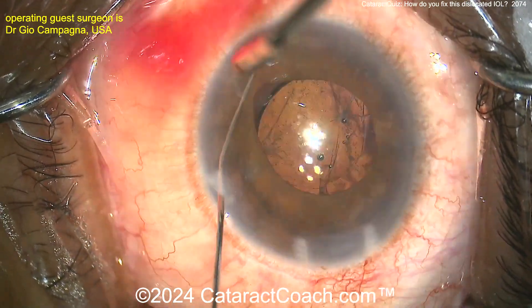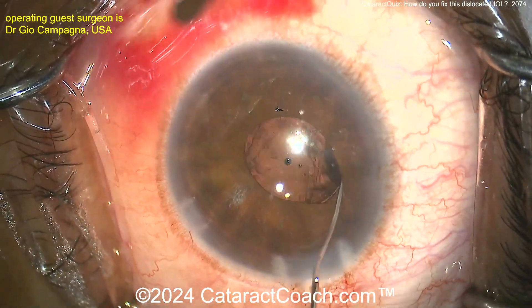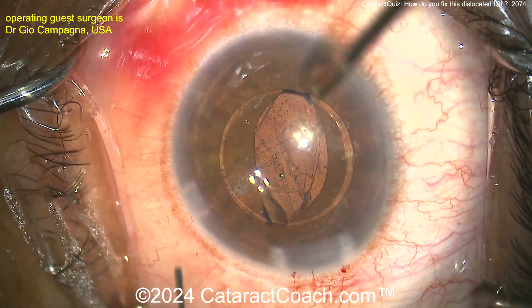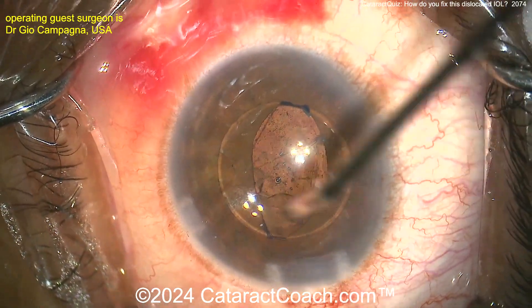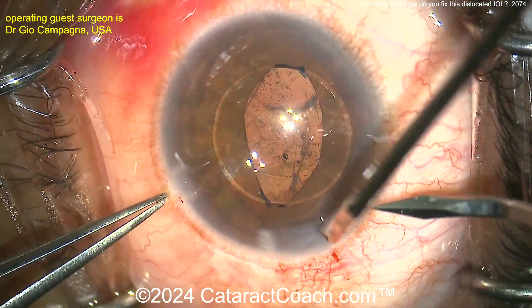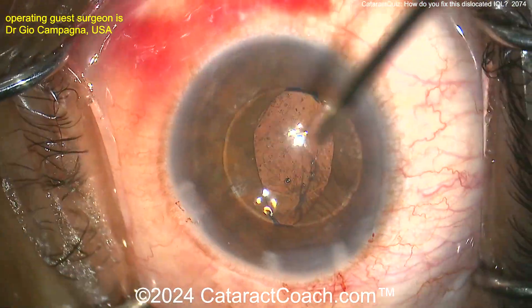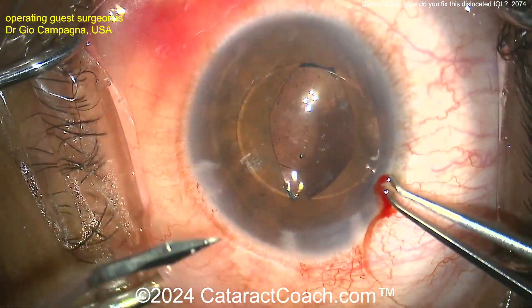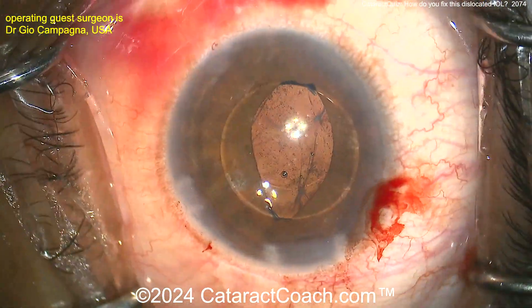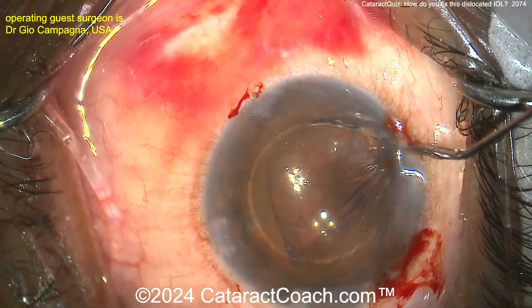Let's take a look. Bring the pupil down with a miotic agent, then bring the optic up. We're going to suture the haptics to the iris. Now remember, you can definitely fixate a lens by suturing the haptics to the iris; however, you need to have some degree of capsular support. You can't just have the 10-0 polypropylene holding the haptic to the back of the iris with no capsular support, because that's prone to breaking off later — too much weight, too much stress.